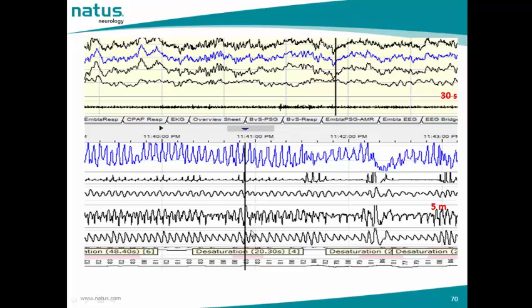The black bar is called the indication bar, and the function of this bar is to synchronize the time. When we set two different worksheet templates on two different time bases, the first trace in the second worksheet template is the PTT signal, and then we have the flow, thermistor, thorax, abdomen, and desaturation.